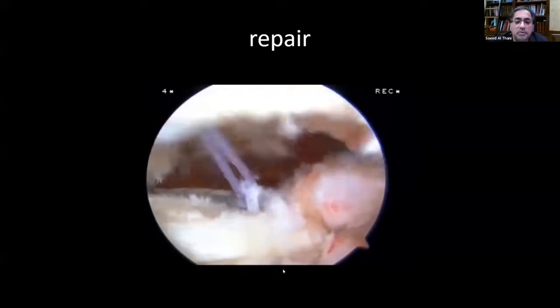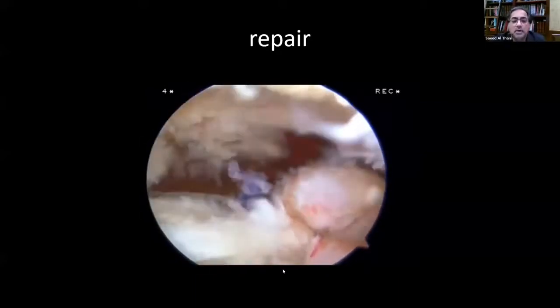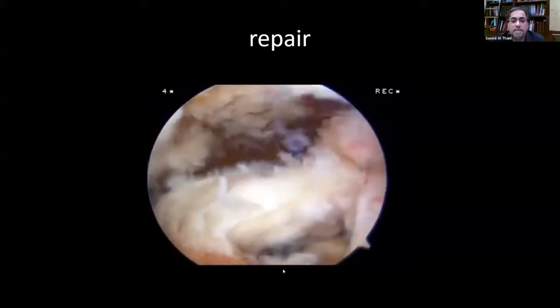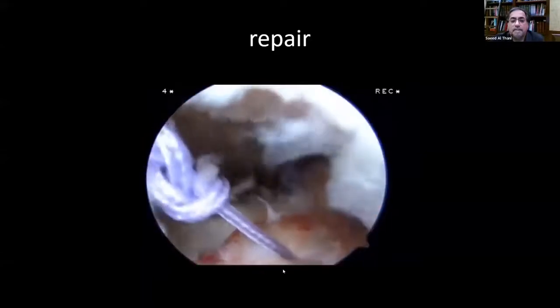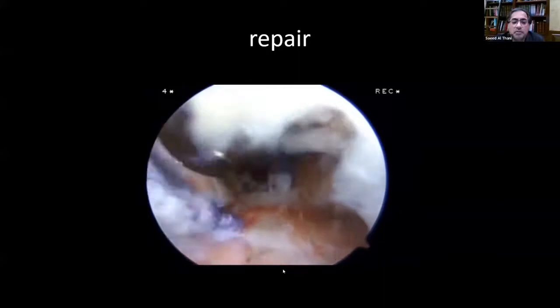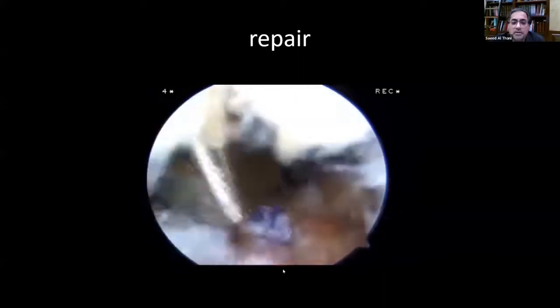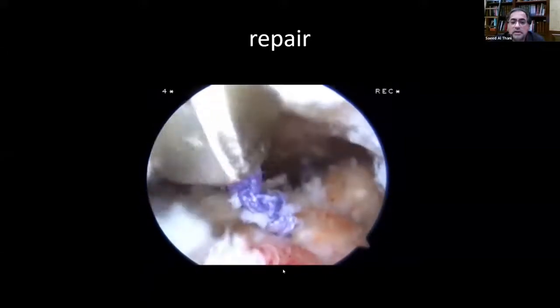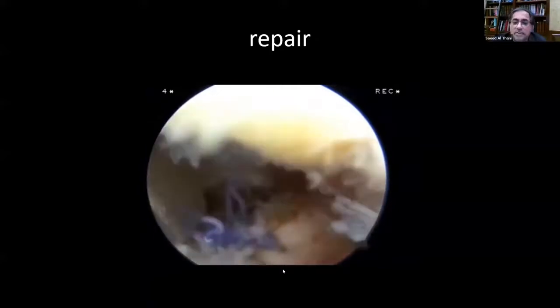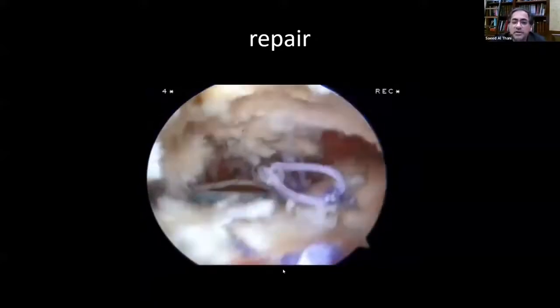After we put that one, I insert two more, one anterior suture, this one for the anterior part of the cuff. And I didn't like the look in the back like a dog ear, so I put one to close it and to push it inside.